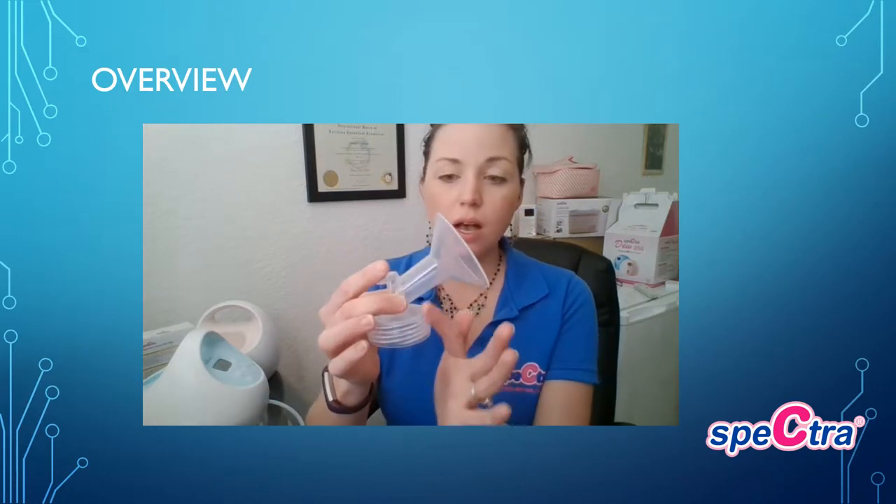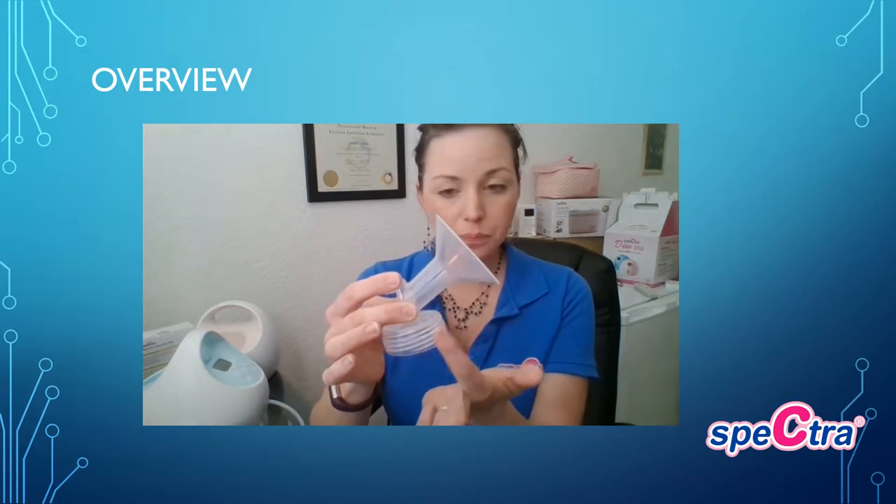With your S2 and your S1, the only difference between the S2 and the S1 is that the S1 has an internal battery and can be utilized without plugging in the AC adapter, whereas the S2 is pink in color, does not have the internal battery, and does require it to be plugged in for usage. But they both do come with the 24 and the 28 millimeter flanges.